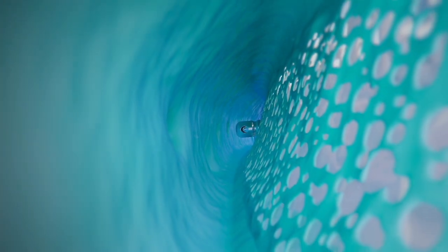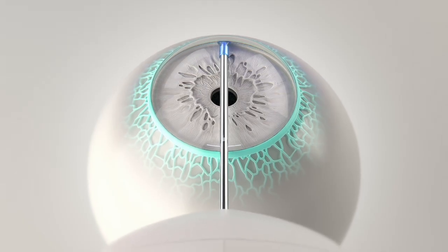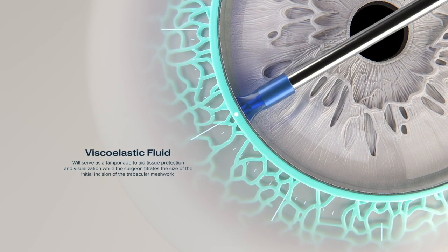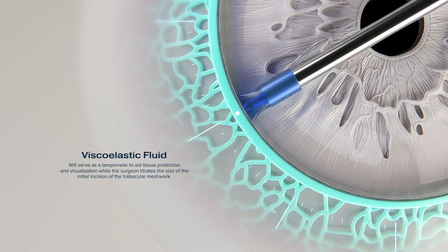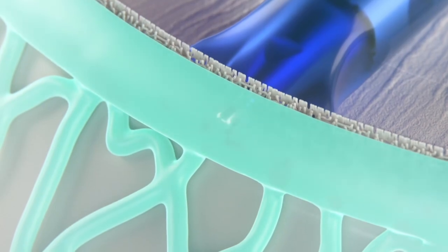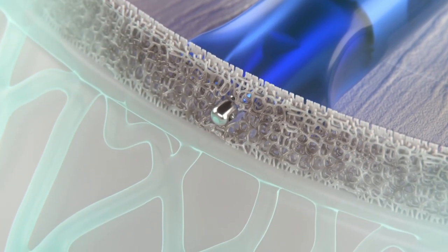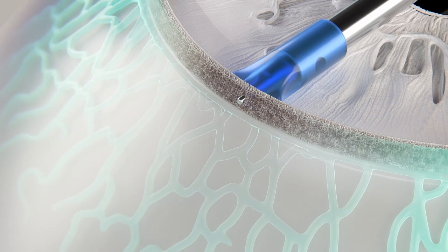With the button fully depressed, the position of the outer sleeve is maintained against the trabecular meshwork for approximately 2 seconds to fully dispense the OVD. It is important to maintain a constant position by not advancing or retracting the inner cannula and outer sleeve when delivering the viscoelastic fluid. Once the viscoelastic injection is complete, a titratable incisional goniotomy can be created with the inner cutting cannula of the device under the control of the surgeon and tailored to the needs of the patient.